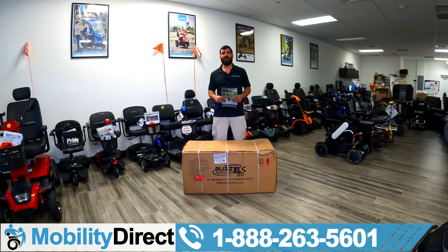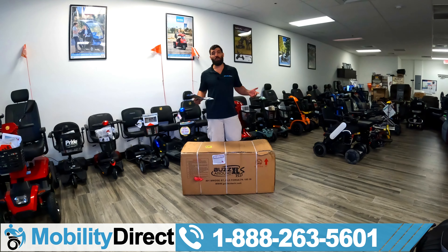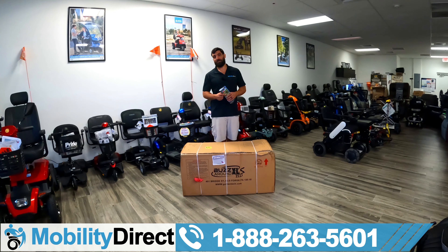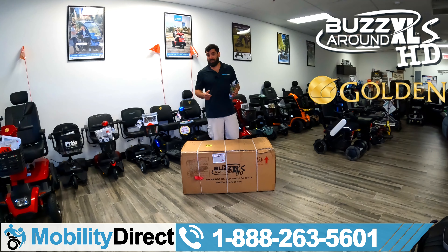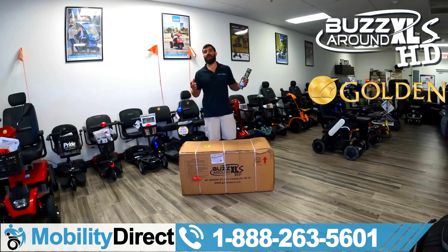Hi everybody, I'm Sergio with Mobility Direct and welcome to our YouTube channel. Thanks for stopping by. In today's video, we're going to show you how to unbox and assemble the Golden Technologies Buzzaround XLS-HD in the three-wheel configuration, known as model number GB-121B-SHZ.